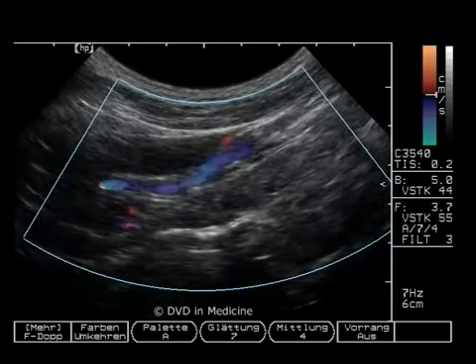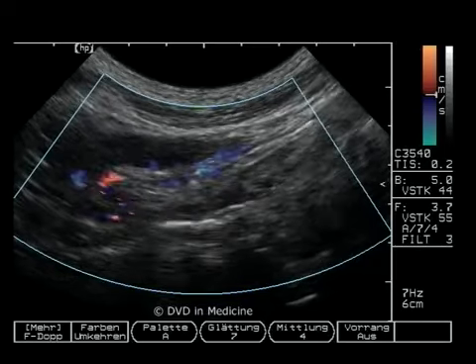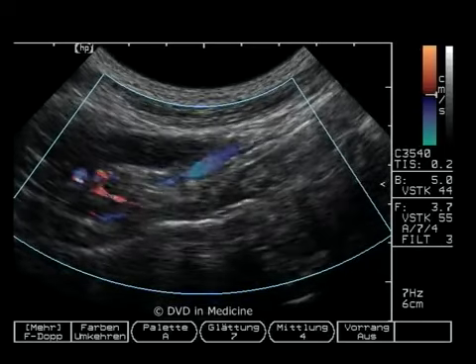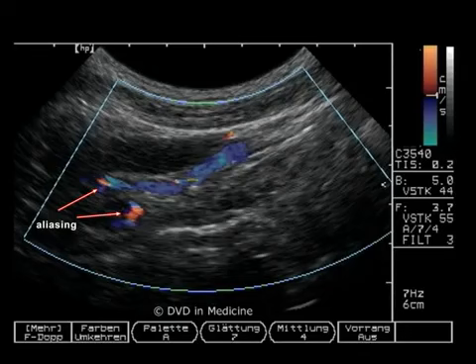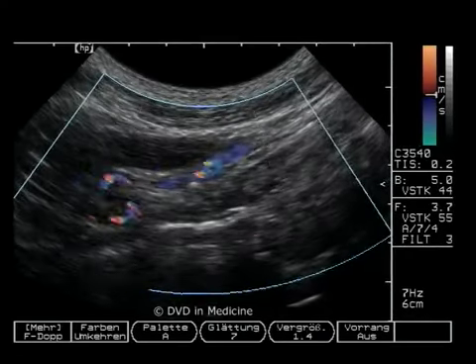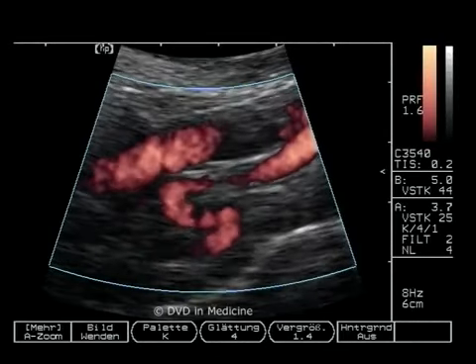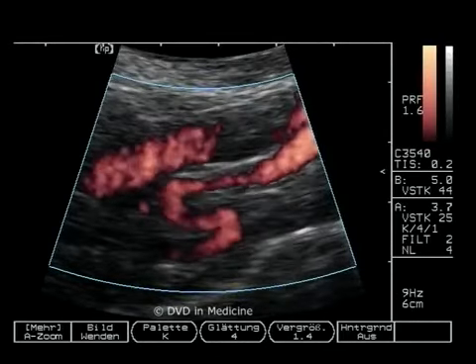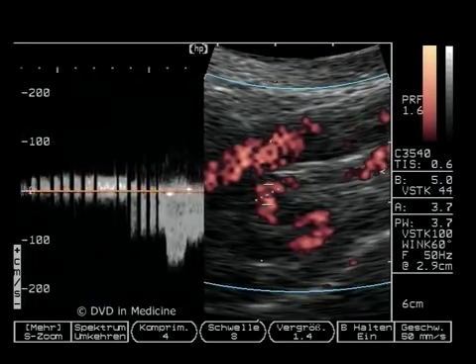The deviation of the artery can cause disturbances of the blood flow, which are local in most cases. When using the spectral Doppler, one should take peak systolic velocity measurements in the places of the artery where turbulent flows are registered.